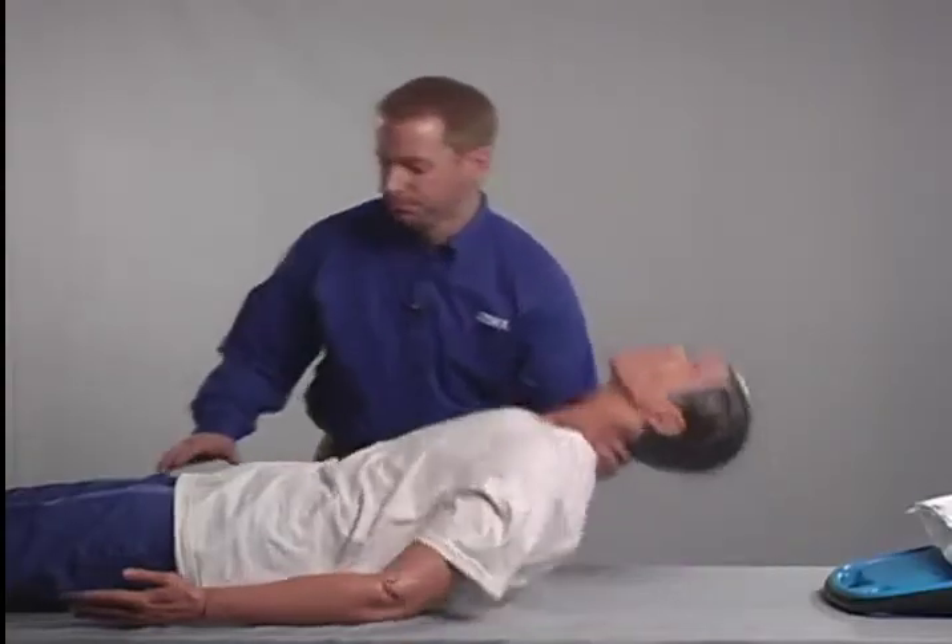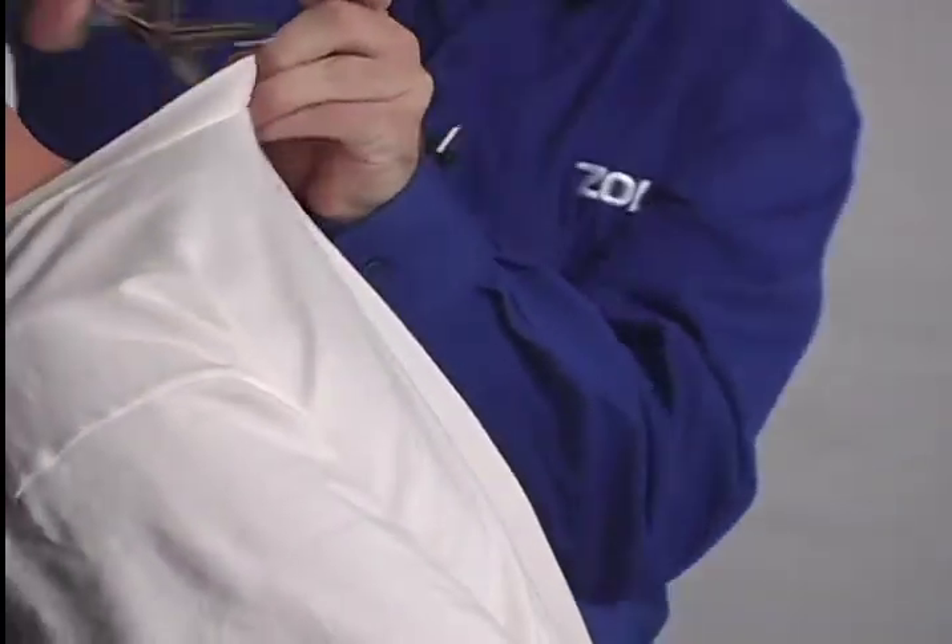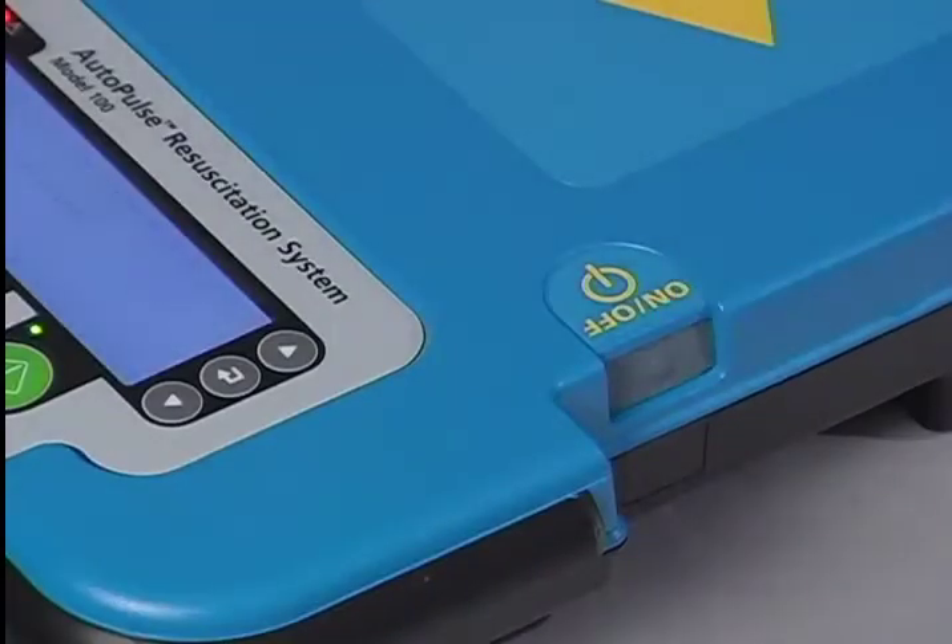Sit the patient up. Perform a single cut of the clothing down the center of the back. Turn the AutoPulse on using the recessed on-off switch at the head end of the platform and slide the board into position under the patient.